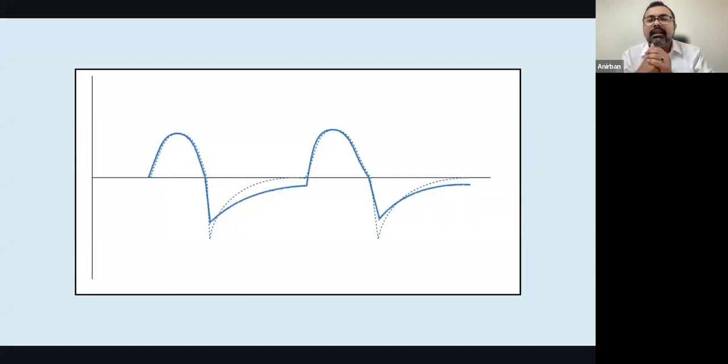So this is seen in cases of our COPD patients who have reduced expiratory airflow, and for these patients, the phenomena of air trapping is very common. And as the air keeps on getting trapped, the end expiratory lung volume keeps on increasing.